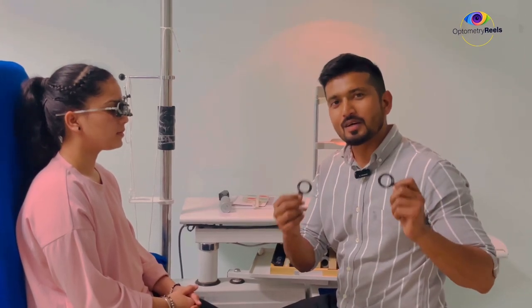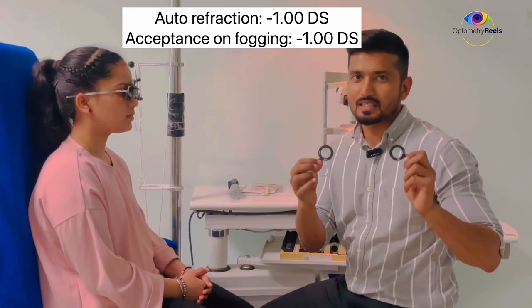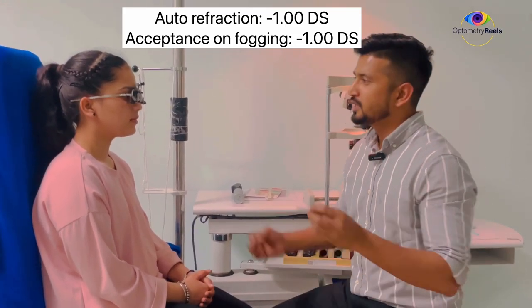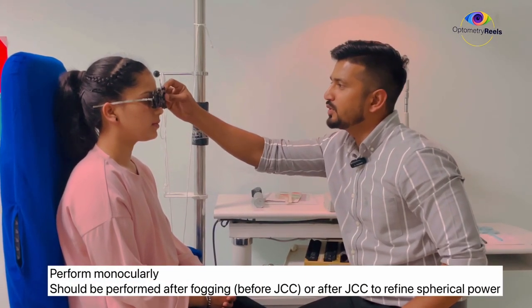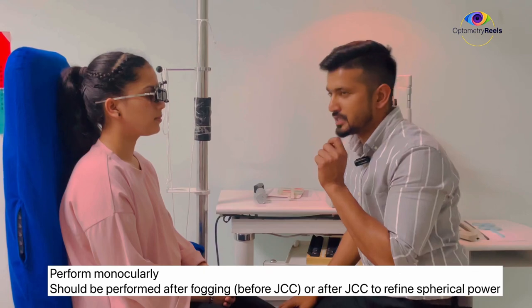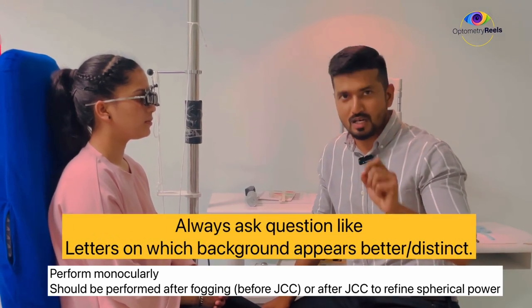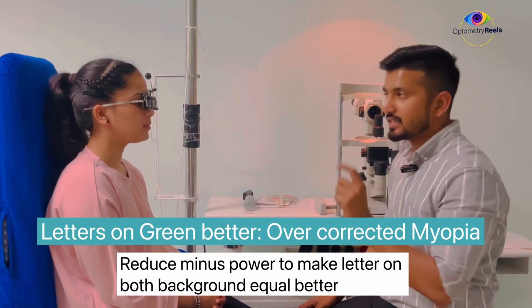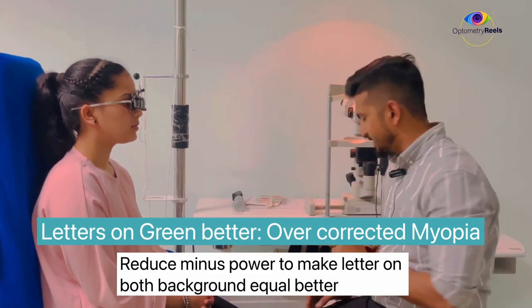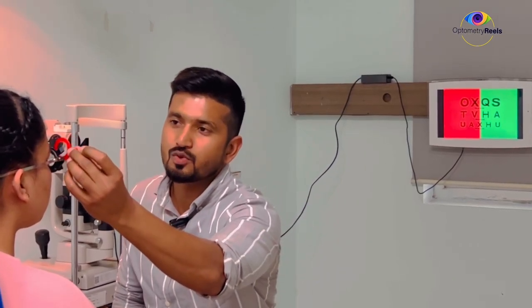Let me show you how the Duochrome test can be done on an actual patient. We have got minus one from the fogging, and the same was from the auto-refractometer, so I am going to put this in the trial frame. Since this test is monocular, I have to occlude one eye and ask for the response. Make sure you ask the patient on which background the letters appear sharper and clearer. The patient responded: green. So green is better, which suggests that in myopia it is overcorrected, and I have to reduce this value.